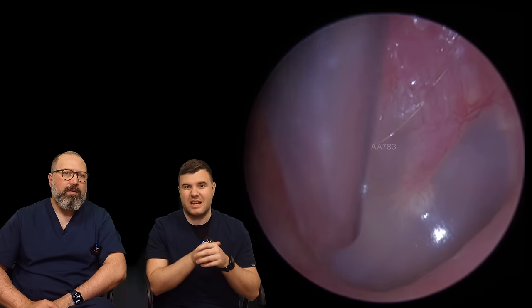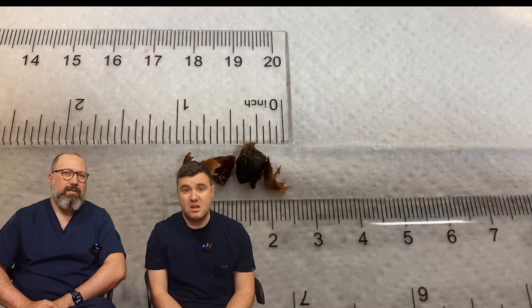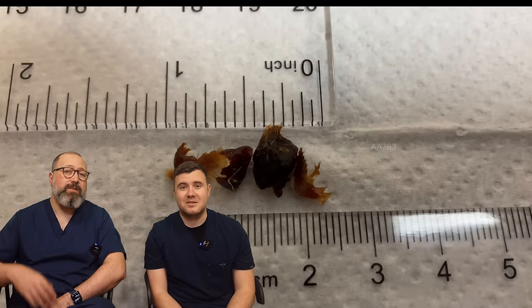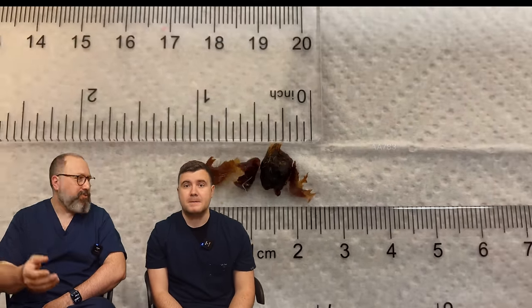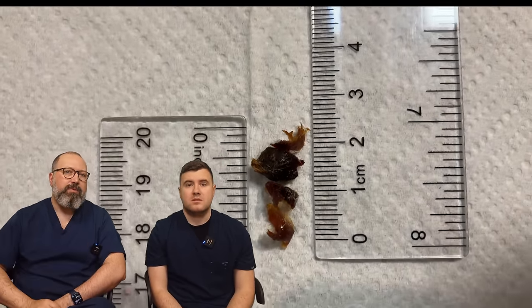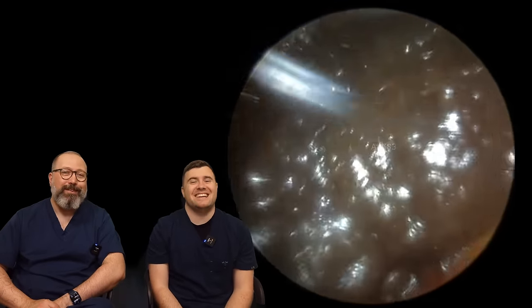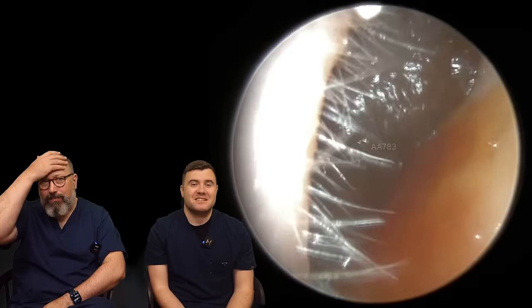Very gently again — we don't want to leave any little pieces in there. There's a little bit of dead skin holding on, and that's where this wax was holding in place, so we're just clearing up that tiny little bit. There we go. A little bit of irritation there, but I think that's to do with where this wax has been in there for so long. It does get a little bit irritated — that migration process with the skin trying to migrate out of the ear canal, with that hard layer there holding on to it. So we've got an inch — two and a half centimeters. Another one.